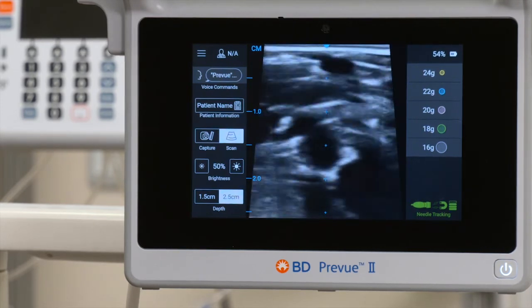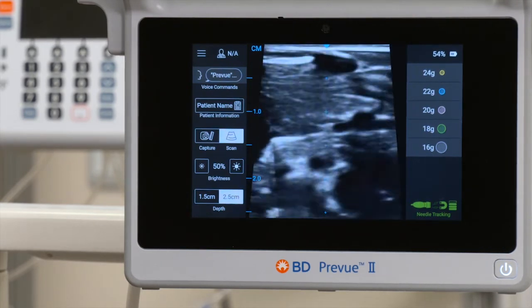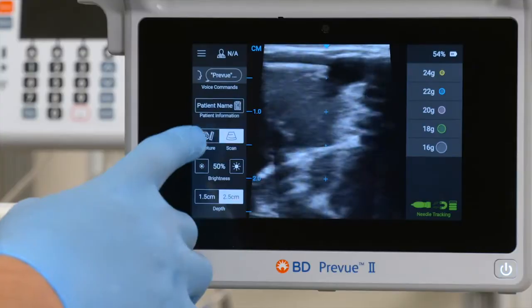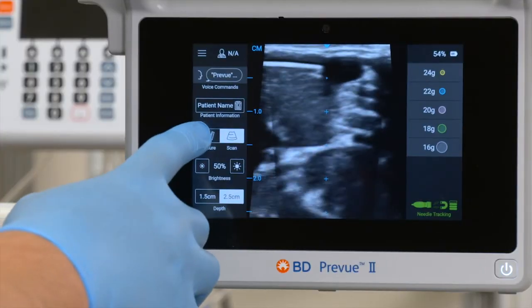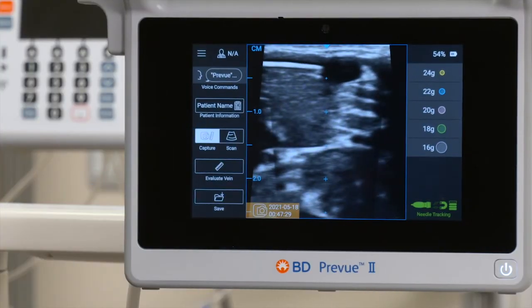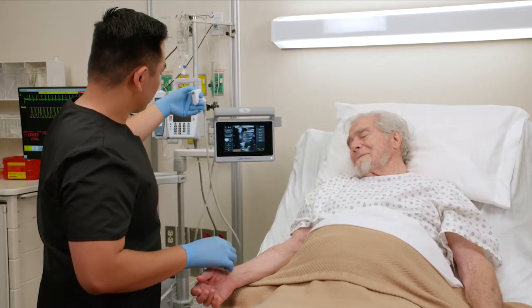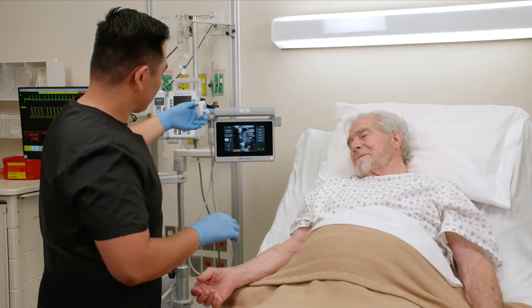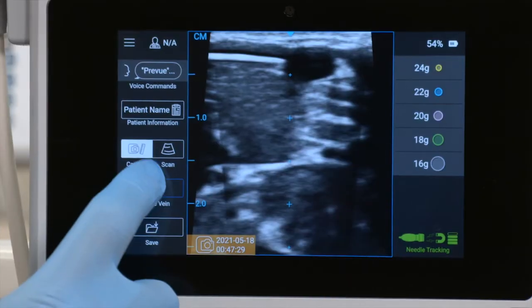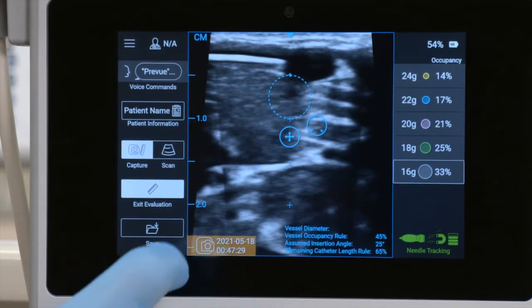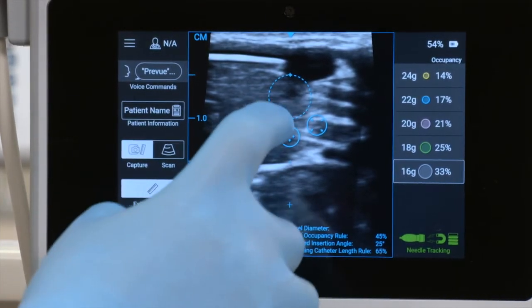With the candidate vessel on screen, select the Capture button. Then select the Evaluate Vein button. Adjust the measurement tool to align with the candidate vessel.